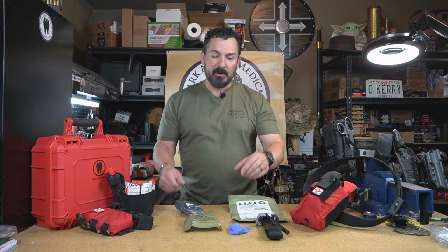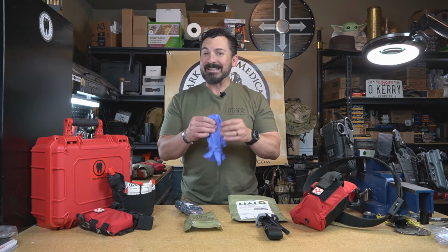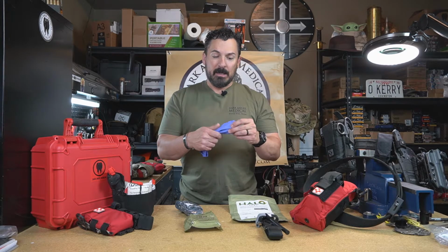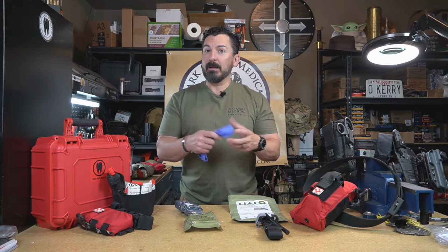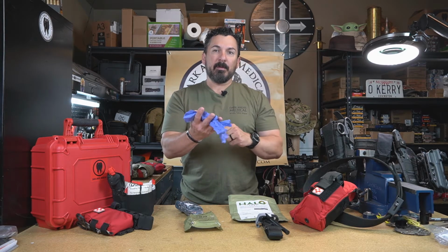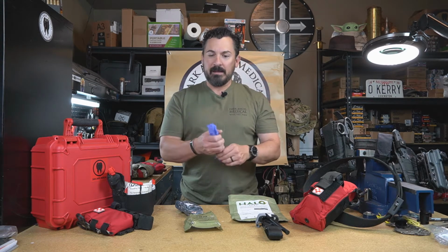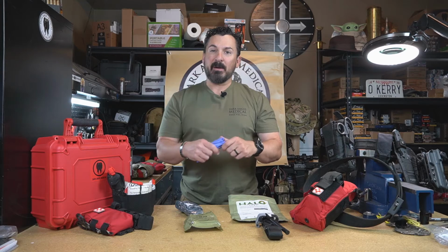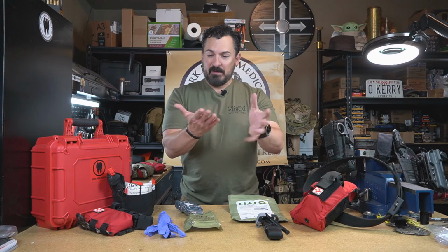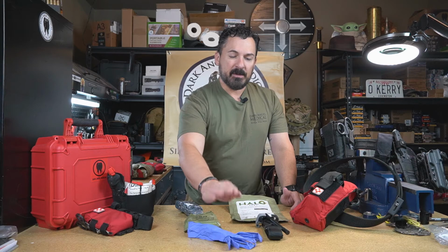All right, first off, you need protection from cooties, okay? Gloves should be the first thing you put on and the last thing you take off. So a pair of nice thick nitrile gloves, multiple pairs, that's another important thing. Carry more than one pair, because if I'm putting a pair of gloves on, I like to slide that other pair on right over it. That way, if that pair gets soiled, torn, anything like that, I can take it off, and I've got a fresh pair of gloves underneath. Because if you try to get another glove on after you take them off a nasty sweaty hand, it's not happening. So at least a couple of pair of gloves. Okay, so there's some gloves.